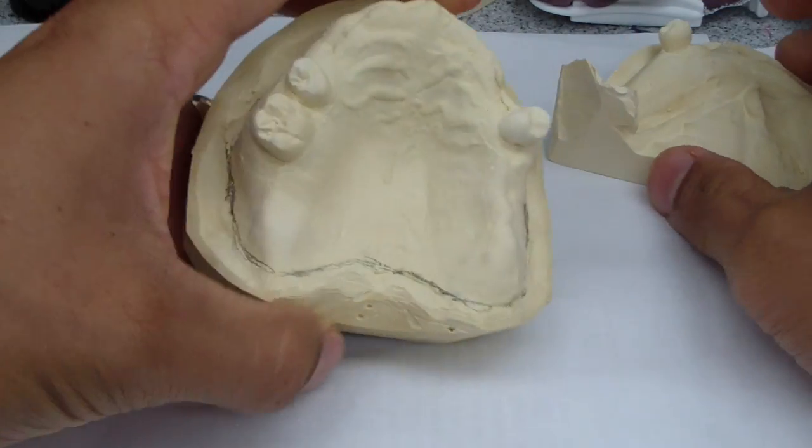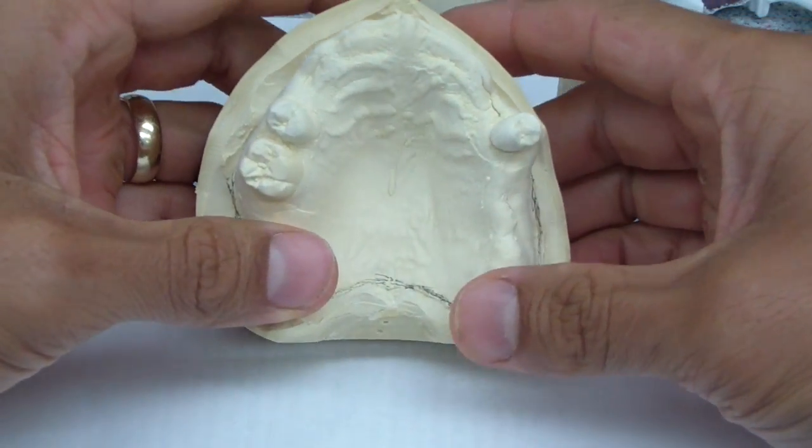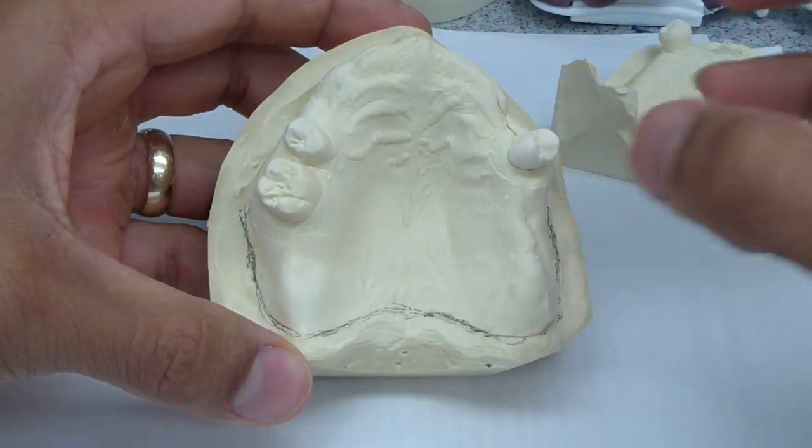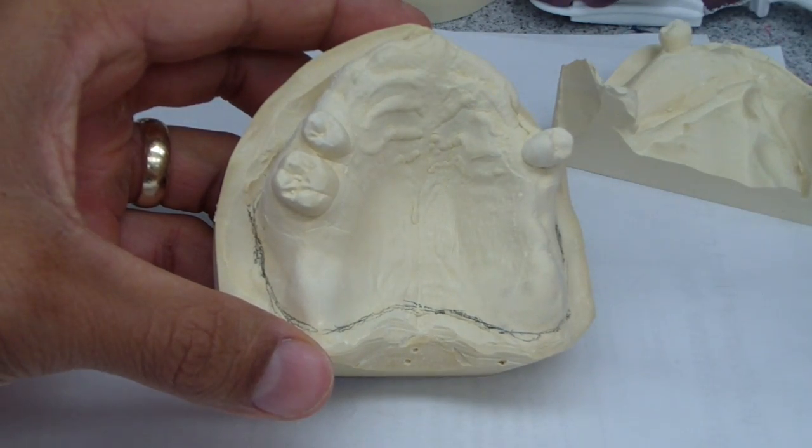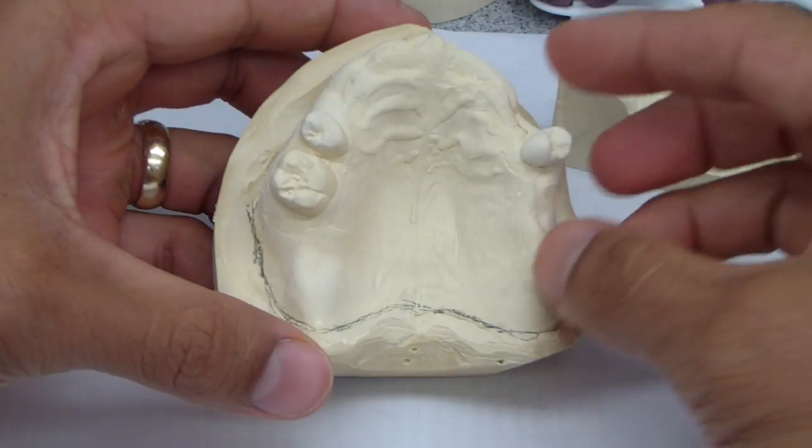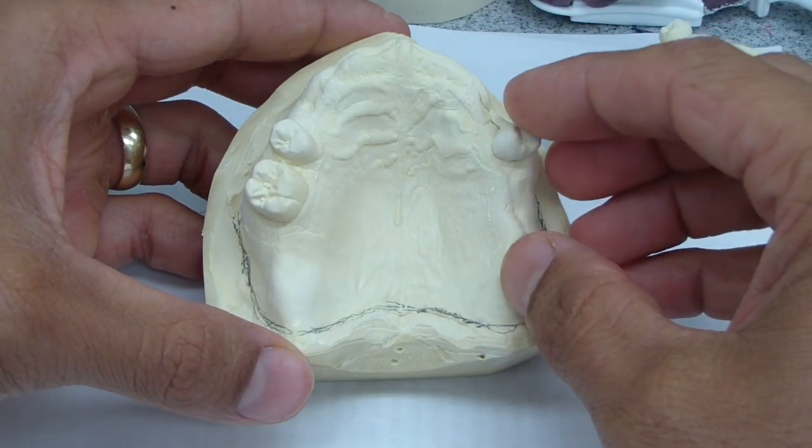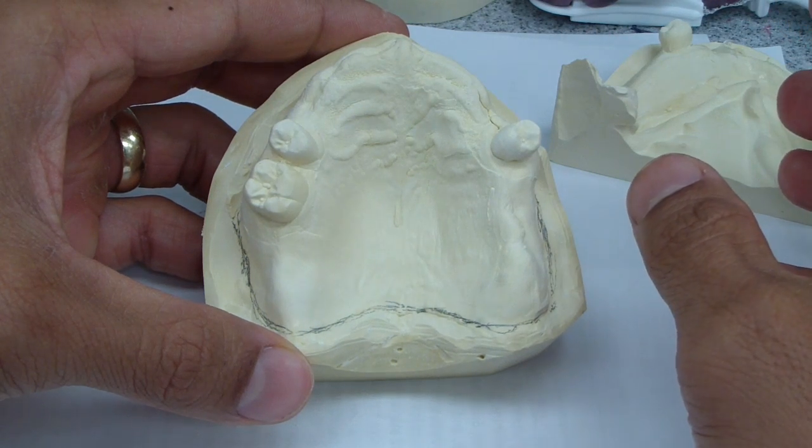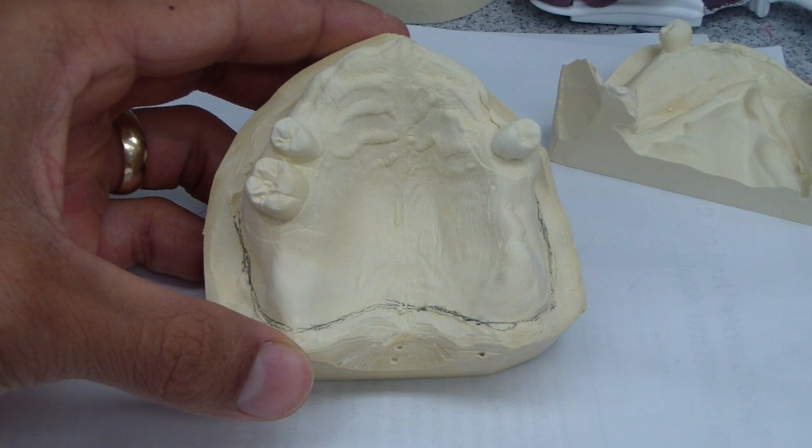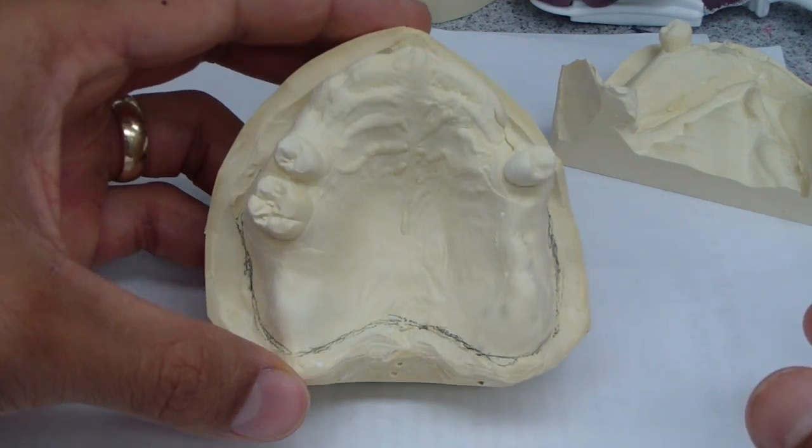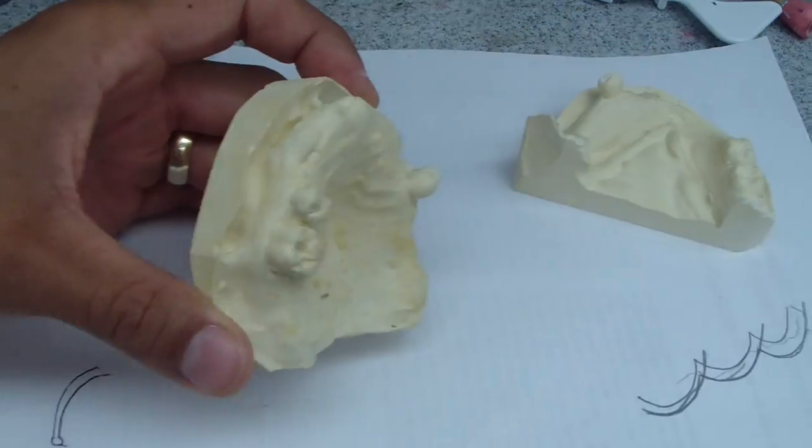Which then comes out with this, my final cast. The follow-on videos will show you what I did, and was essentially taught, how to use a sectional impression technique to get to this stage. Now, the next stage after this is fabrication of a record base to obtain a maxillomandibular relationship record, interocclusal record, whatever you want to call it, of Aaron's maxilla.